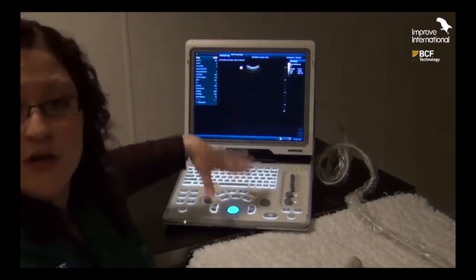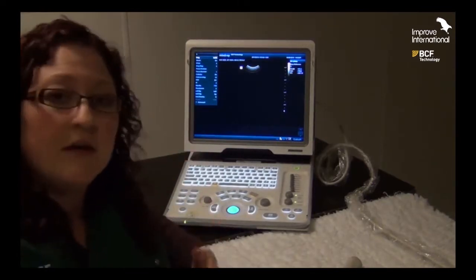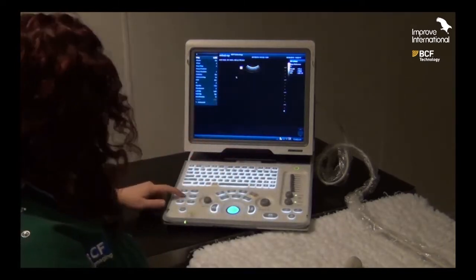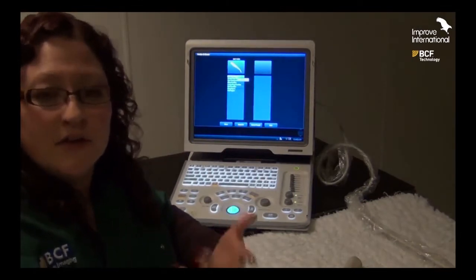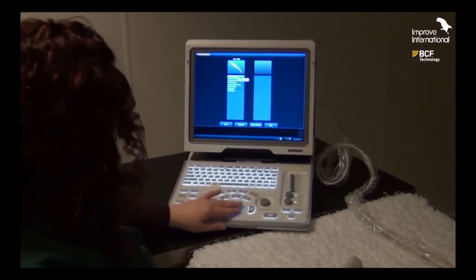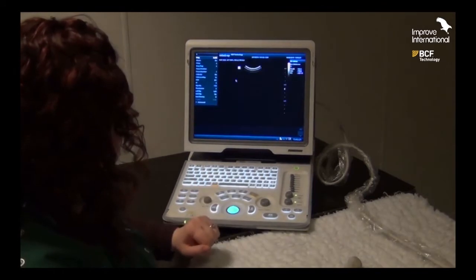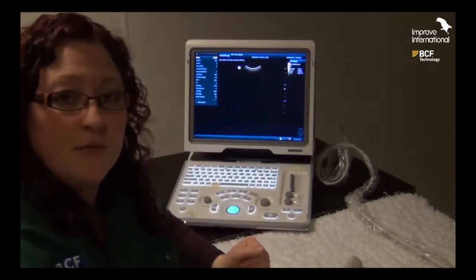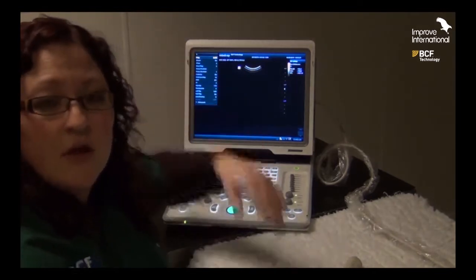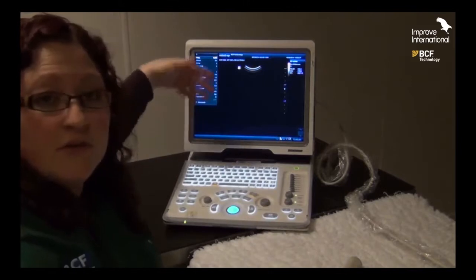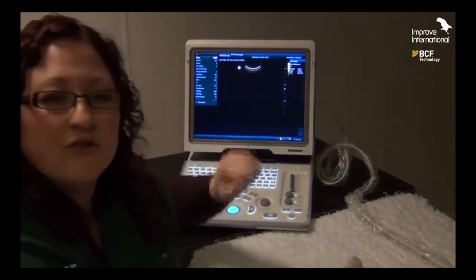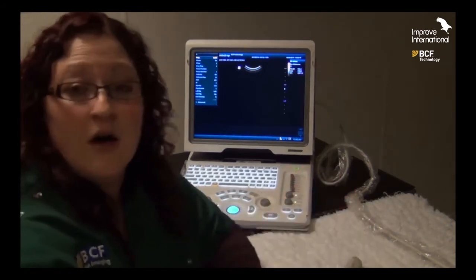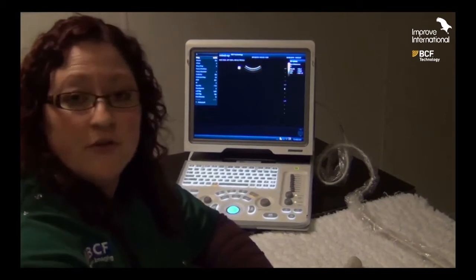Look at the machine that you're using and find something called preset, setting, or exam type. On this particular machine it's under probe. What we will be performing today is a cat abdominal scan, and so we will choose that. As you can see, it has changed quite a few of the parameters — ones that we will be changing later on throughout the examination, but also ones within the menu. This means things like contrast, dynamic range, and edge enhancement don't need to be changed every single time. It's helpful for efficiency and to ensure the best possible images when we start scanning.